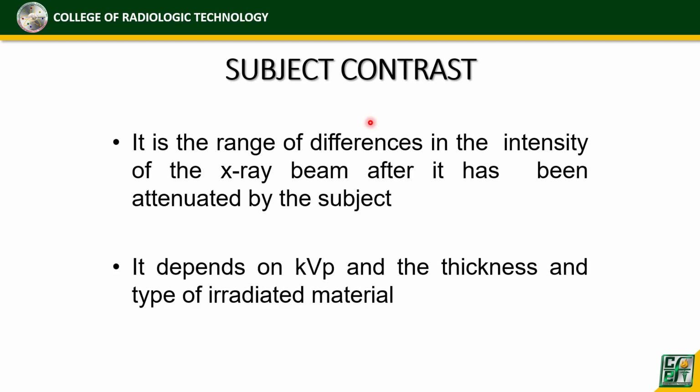So kung yung radiographic contrast ay nagde-depend sa film screen, sa sensitometric curve, saan pa? Apat yun, di ba? Film density, saan yung pang-huli? Ano yung pang-huli?